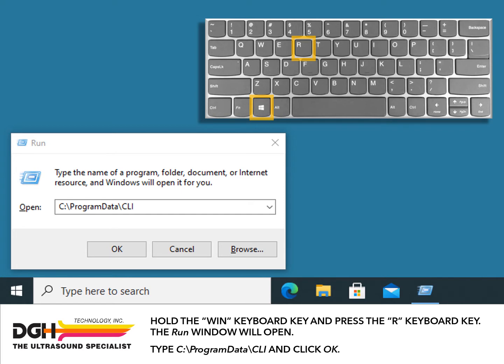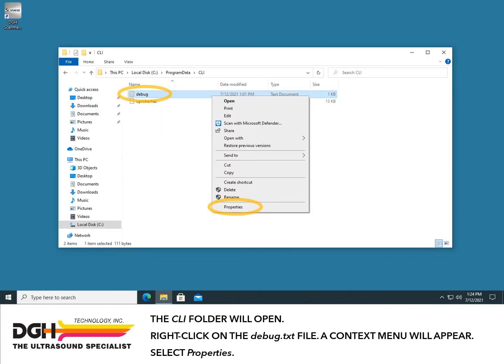The Run window will open. Type C:\programdata\CLI and click OK. The CLI folder will open. Right-click on the debug.txt file.